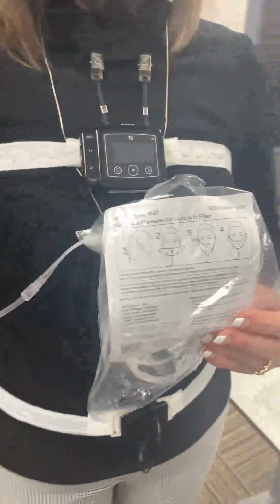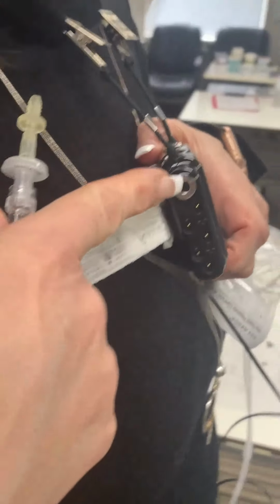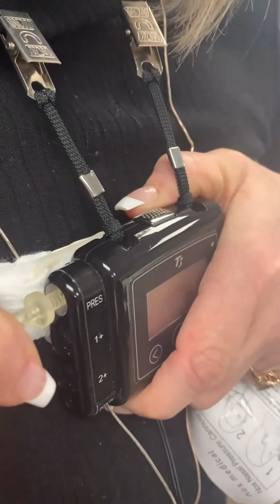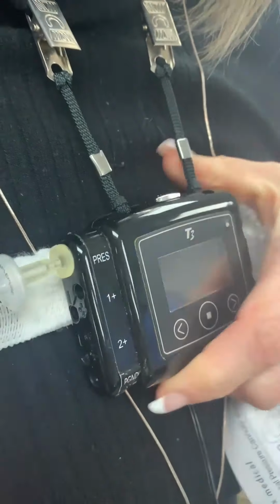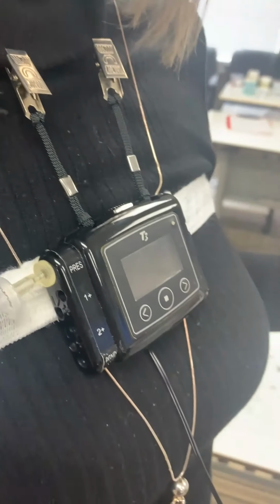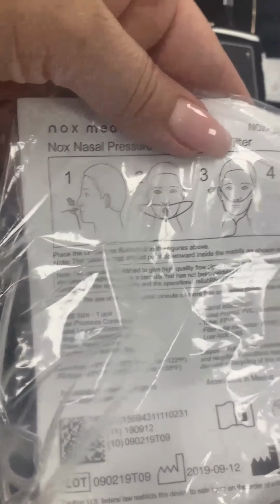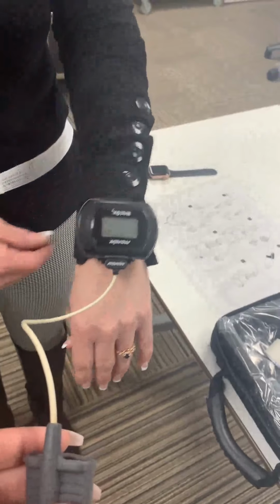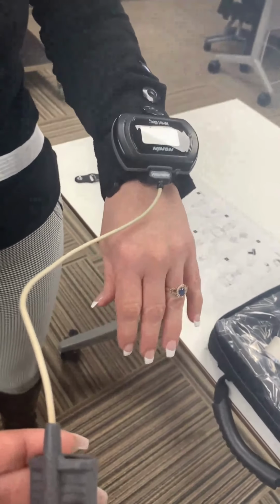The cannula. The cannula goes on the side of the computer. Just make sure that you push it and secure it properly. There are drawings to follow on how to successfully attach it to your nose. The last and most important component is the oximeter.